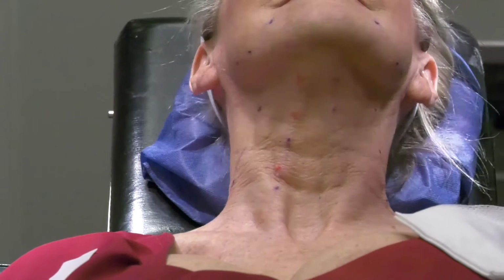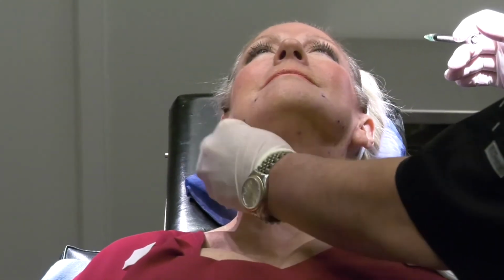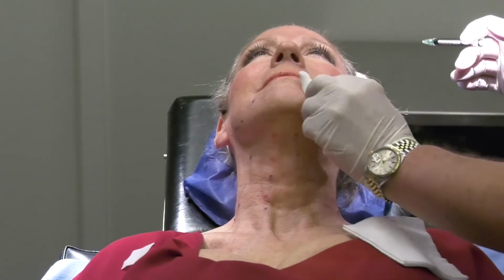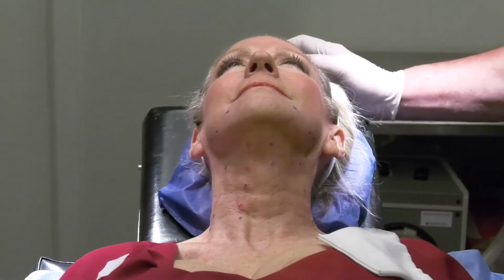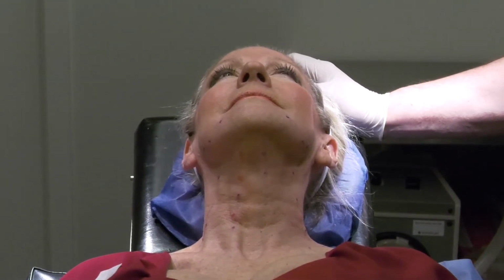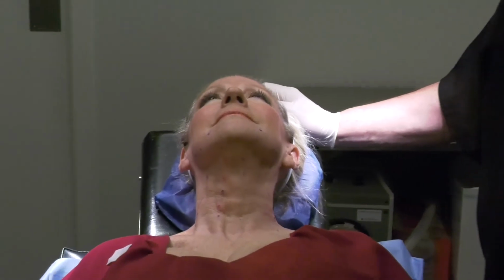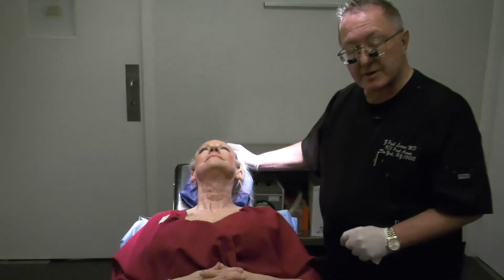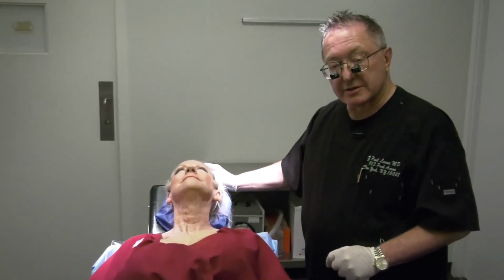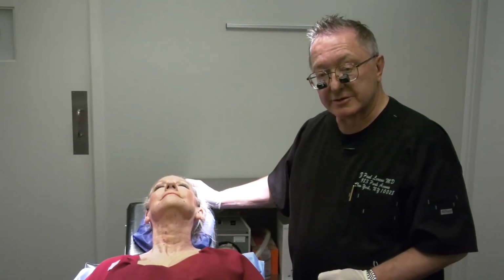Just straighten it out. The total dose was 48 units. That's my standard dose, whether I'm using Botox or Xeomin. I have the patients resume full activity the next day, and typically I will see the patient at 1 week in follow-up, and we take typically post-injection photographs with full animation.